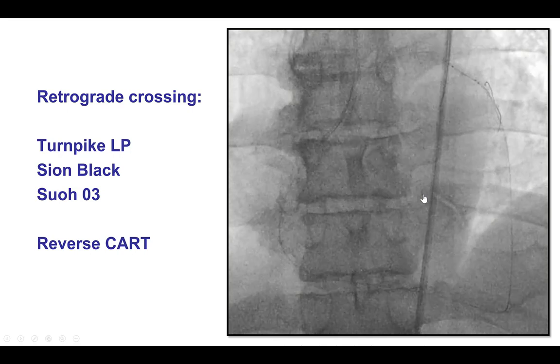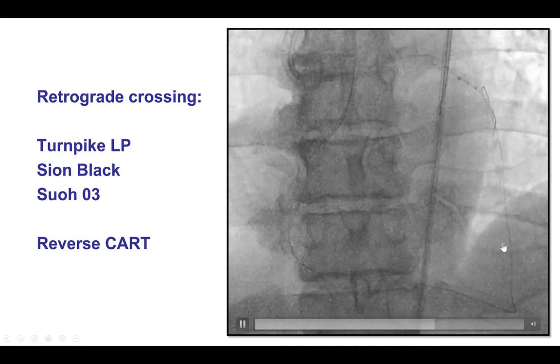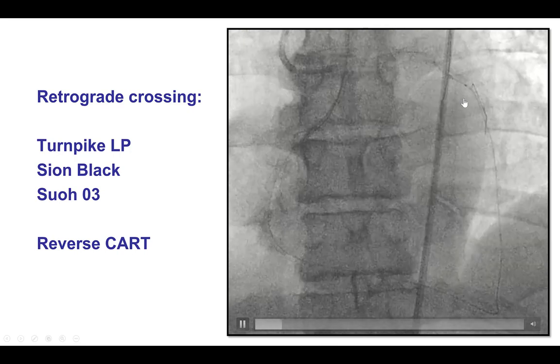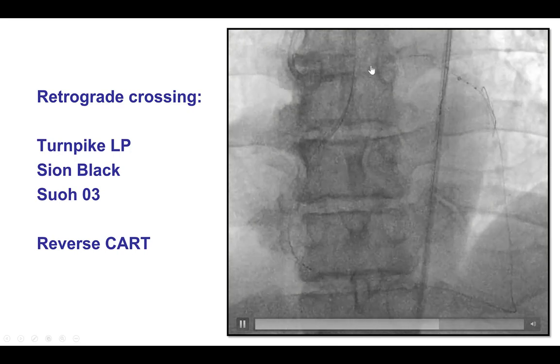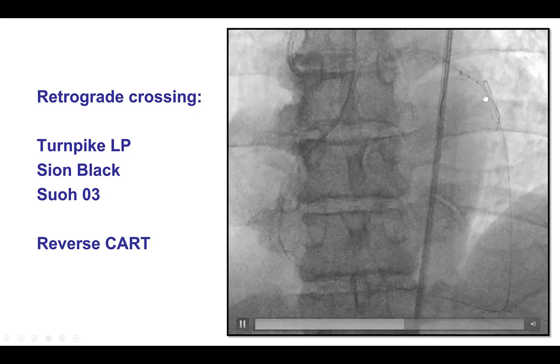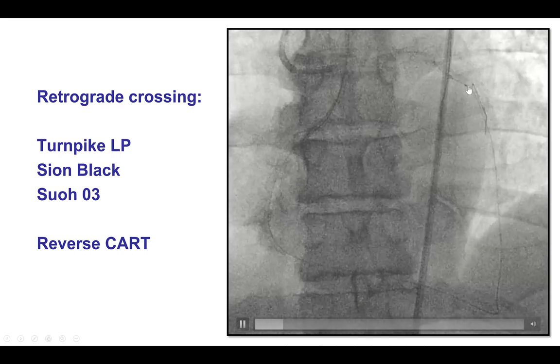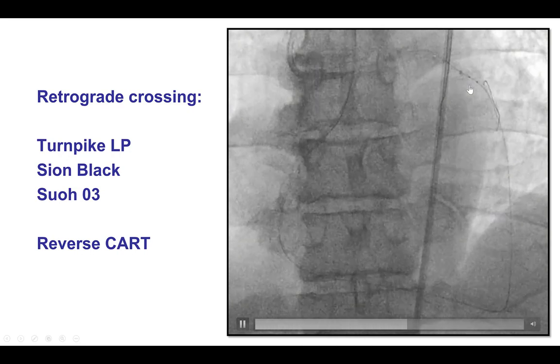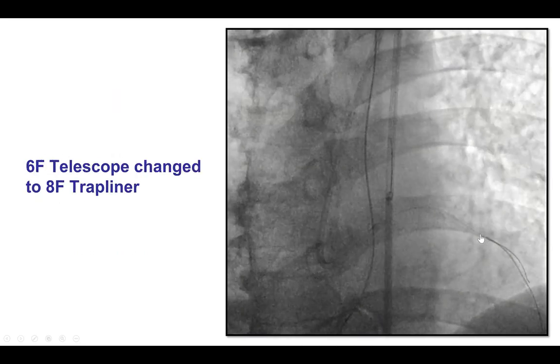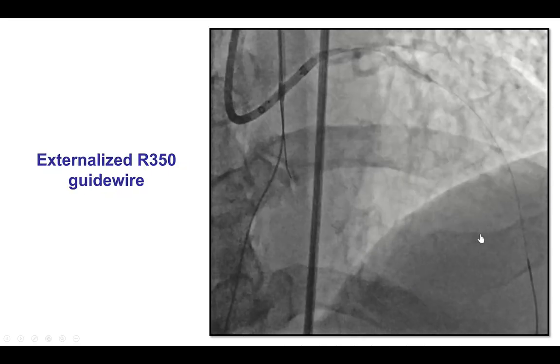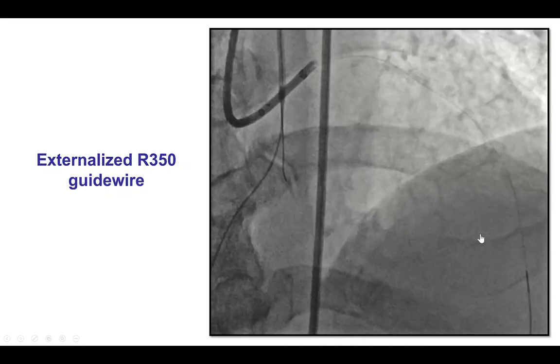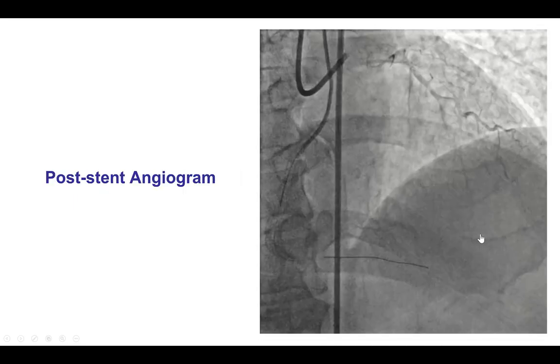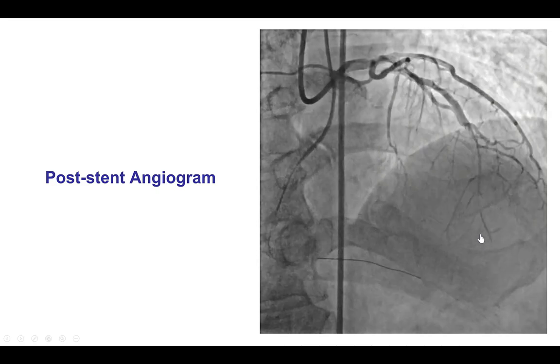As a result, we switched to retrograde crossing through a septal collateral from the right coronary artery, and then we were able to perform the reverse CART technique. We had a guide extension into the LAD to facilitate retrograde crossing, and then we were able to inflate a balloon and advance the retrograde guide wire into the antegrade guide extension. The patient did well during the retrograde approach. We did not have to use hemodynamic support. We eventually were able to externalize an RG3 guide wire and pre-dilated the LAD, then performed stenting.